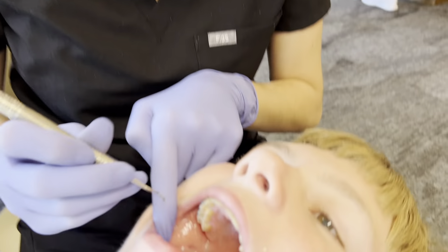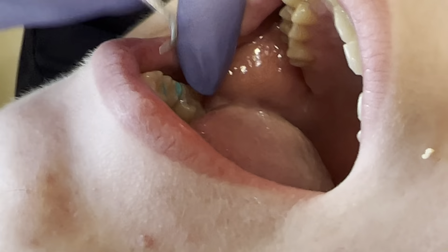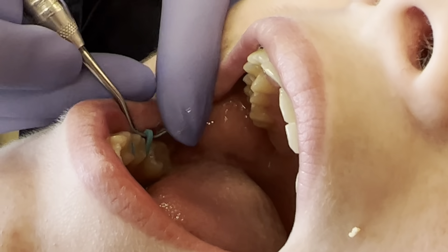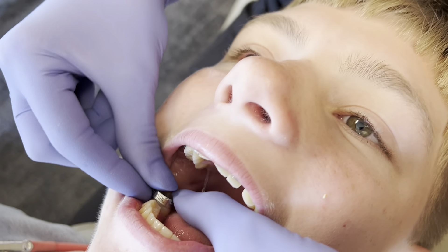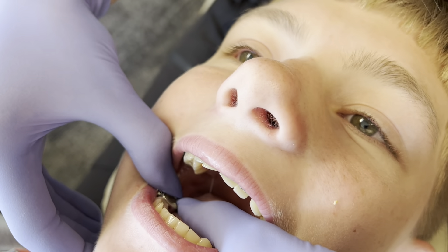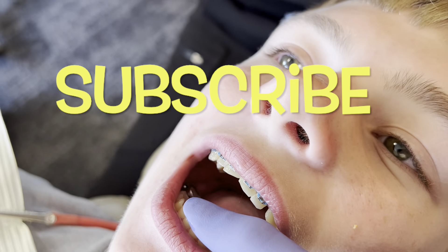So the first thing you're doing is removing the spacers? Yep. And then there's another one right over here on the top. Oh, I got it. It's kind of in this weekend, yeah.